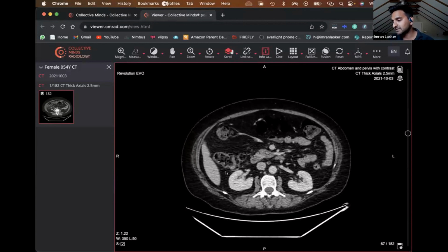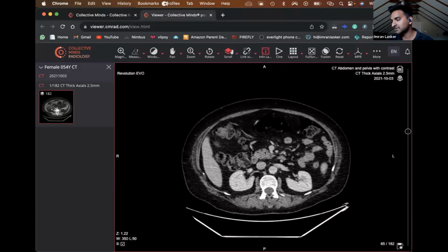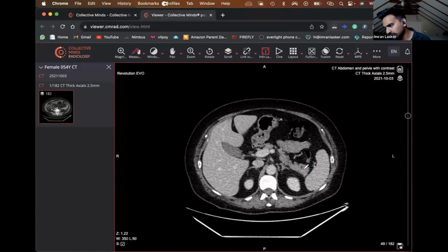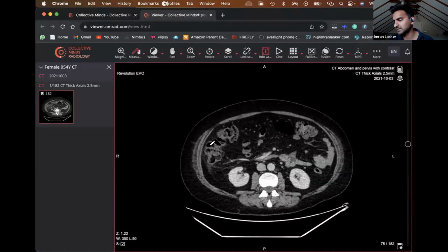Let's have a look at the kidneys now. Kidneys look okay. They don't look particularly inflamed either. And then the pancreas is also one of those big ones that cause a lot of abdominal pain. Pancreas, that is that kind of fluffy thing. I'll show you here, going along like this, all the way along. It looks okay. Doesn't look particularly inflamed. So we're not looking at pancreatitis either.